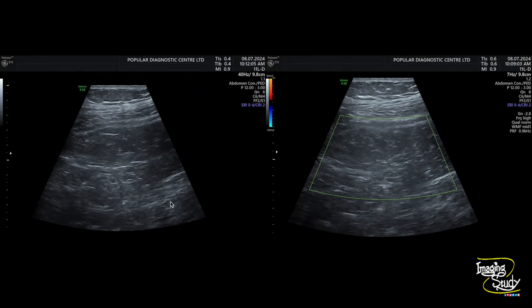This is the high-frequency ultrasound picture. We have applied color Doppler and there was no aberrant vascular flow within or around the lesion.